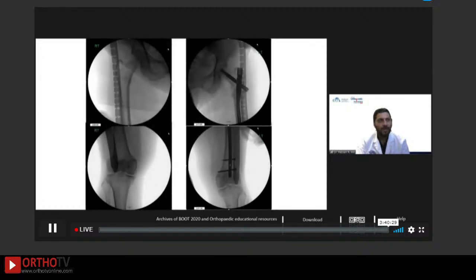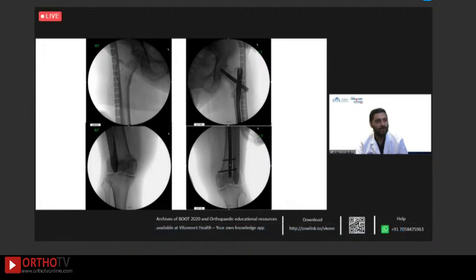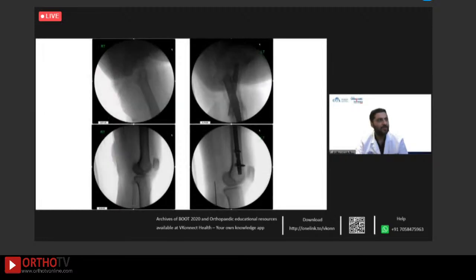So I decided to re-nail it. I like compression, but I don't think nailing and compression go against each other per se. So I always like to measure the contralateral limb. That shows you her 1 centimeter discrepancy. She's 39 centimeters on the right, 38 on the left. For rotation, which I don't think is as accurate as what I'll show next, which is looking at femoral neck version on the lateral. And then obviously your varus valgus neck shaft angle you can compare here. This is looking at the lateral. You can see that her anteversion is off by at least 25 degrees there. And so that's our planning.